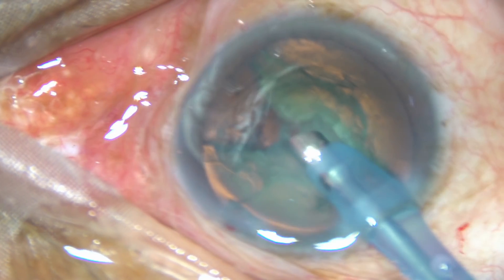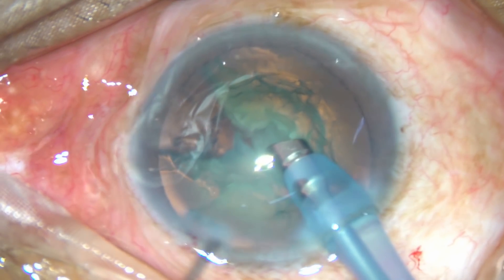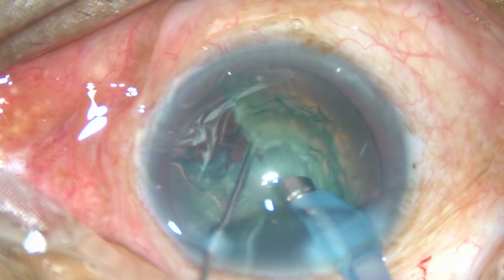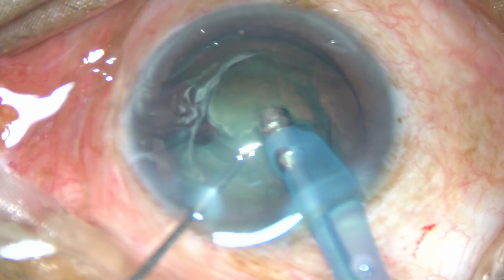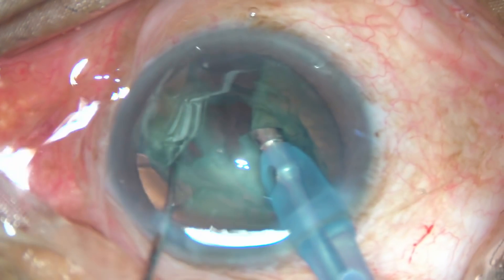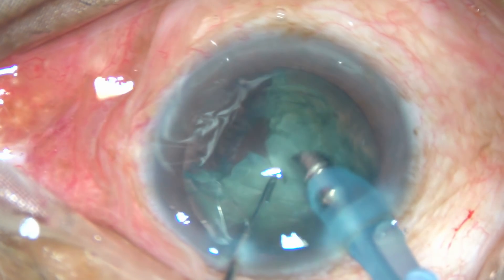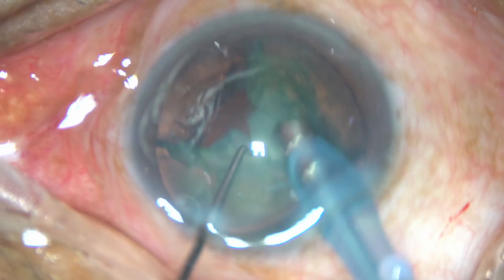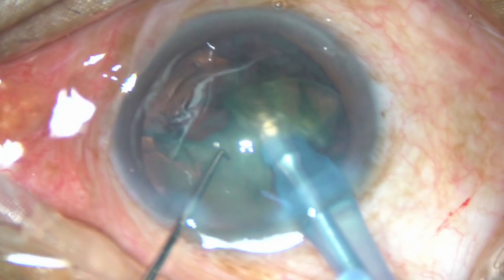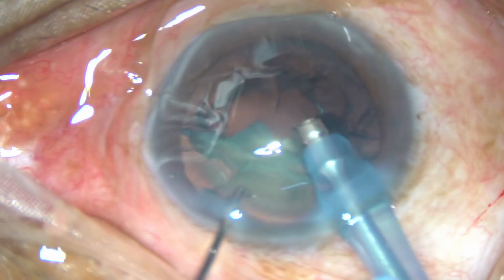Fluid is moving from this crack towards other areas. Now you can see this is the 7 o'clock chop. Hold the nucleus firmly and chop it, and another nuclear fragment has become free — remove it. You can see that the portion on the right side is now free. Emulsify and remove this portion of the nucleus.